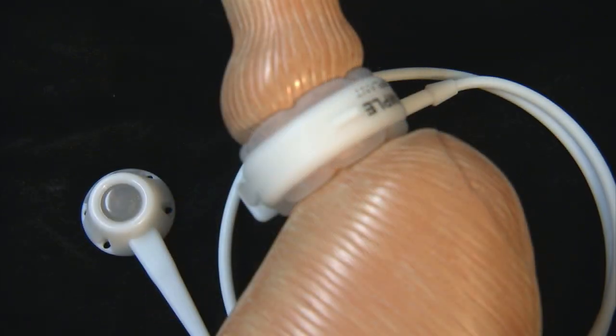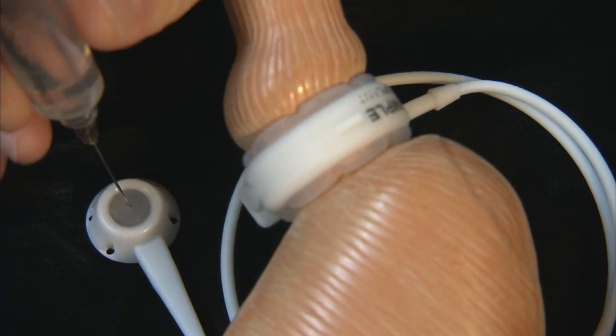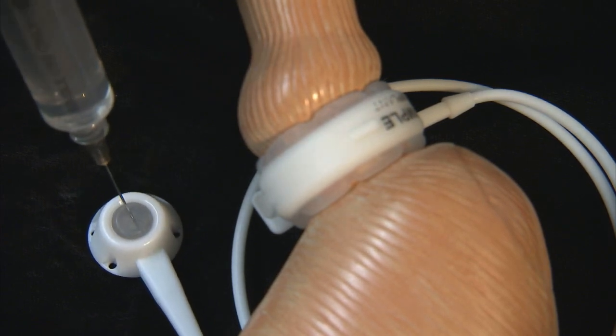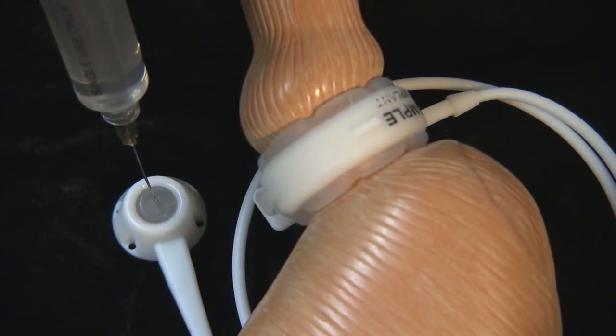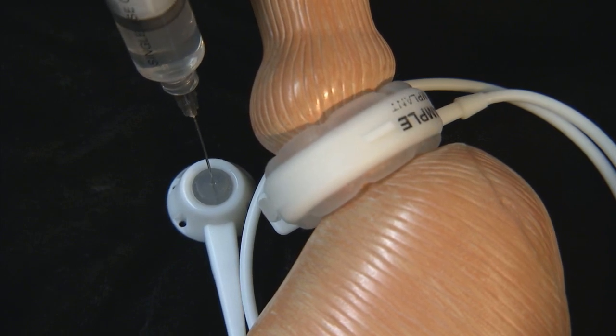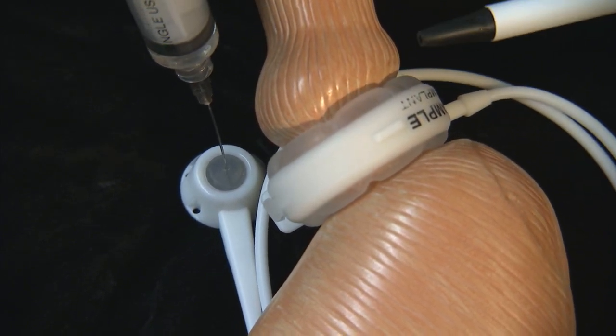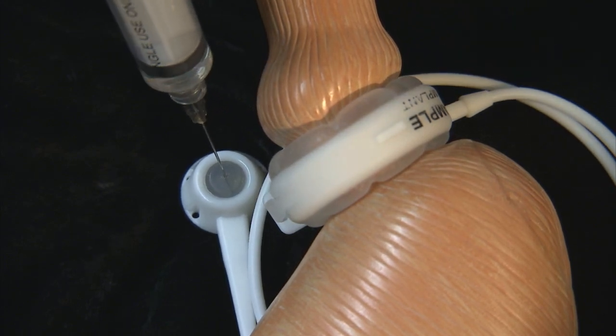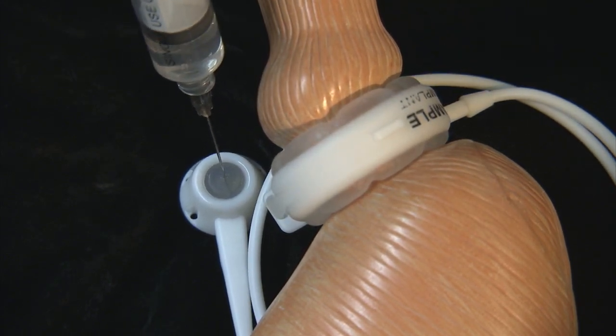I will now inject the port. You should be able to see the balloon inflating as this is injected. You can see this balloon here becoming much larger with saline, and that acts to restrict the top of the stomach so an individual cannot eat as much.